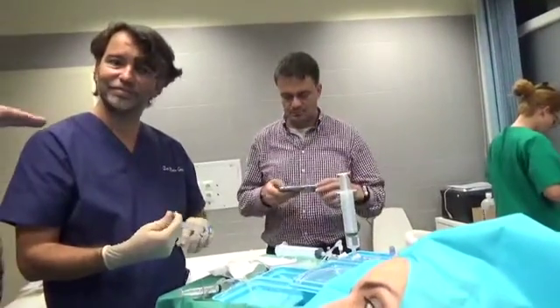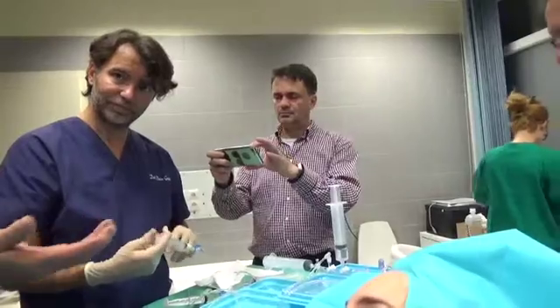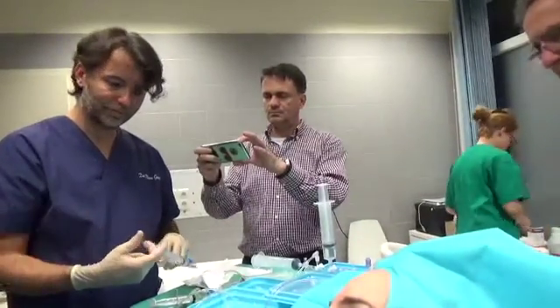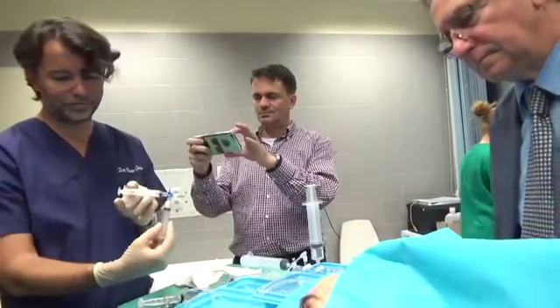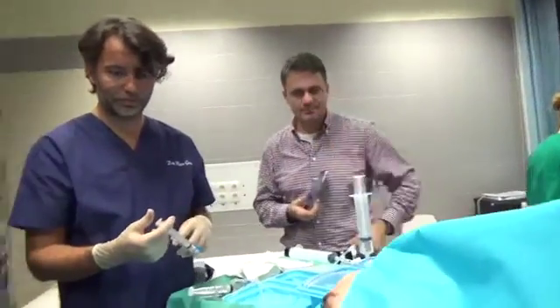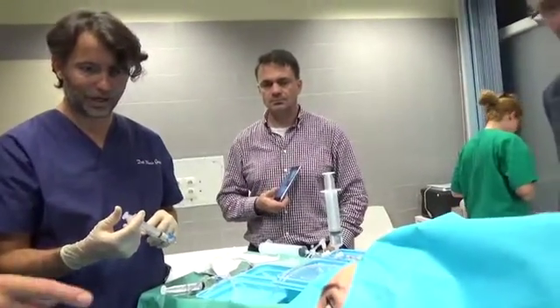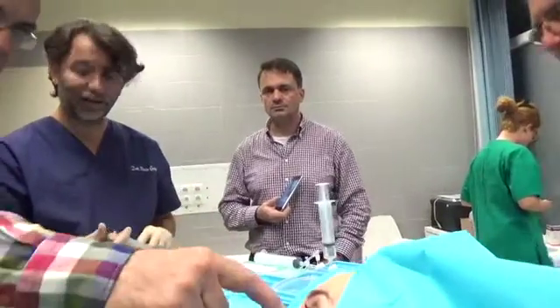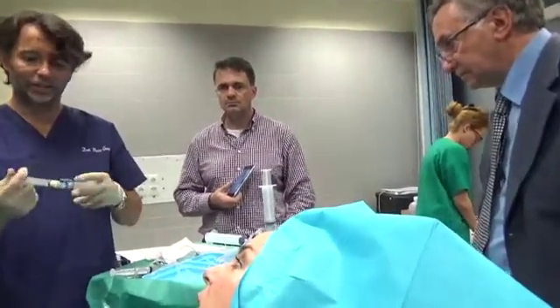It's just not with that needle — it's good with this needle. With that needle? With that needle. But it's a normal needle. Yeah, because also we're not creating hematomas.